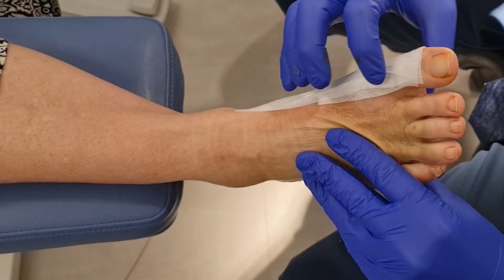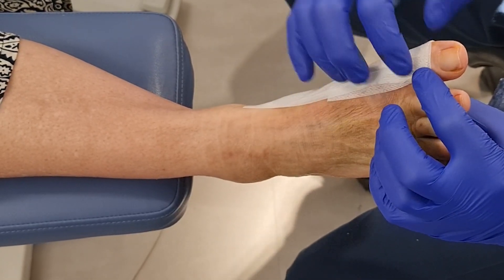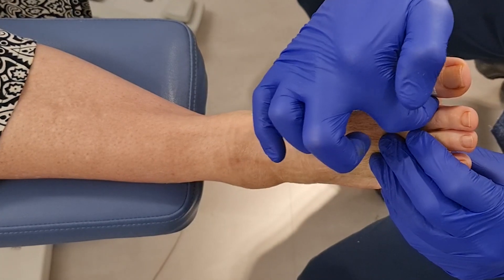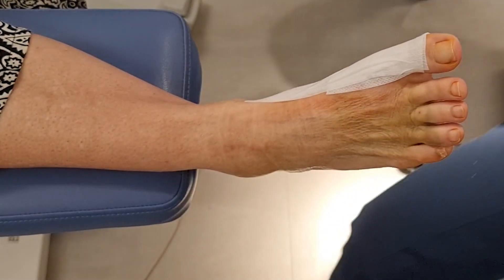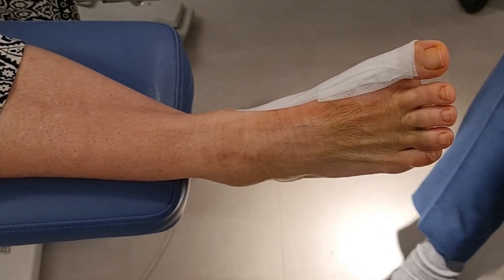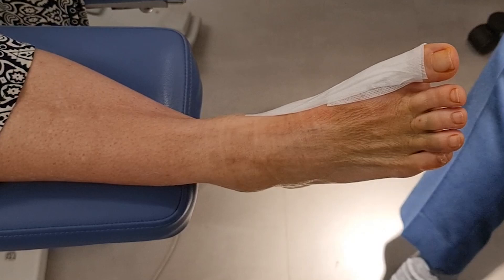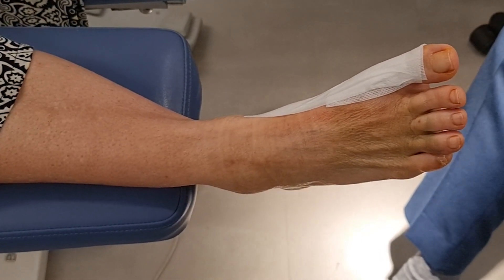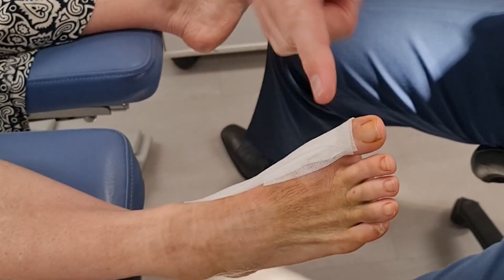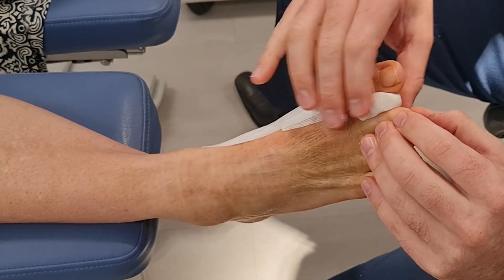We've got a bit of a gap between the big toe and the second toe — the second toe will come back around, but there's no urgency on that. Now we're going to make a little spacer. Some people wear the tape and the spacer at the same time, some don't, and some people hate the spacer — if you do, you will only tape. If you're in a closed-in shoe, you could probably just use the spacer on its own. The reason for the spacer is purely to hold the toe nice and straight, just like the tape, while that joint capsule on the inner side is healing. So this is an alternative to the taping — if you have a closed-in shoe it will stay in place, but in a sandal it'll just pop out, so that's when you will tape. That should hold it pretty straight.